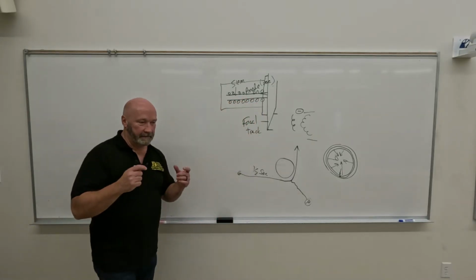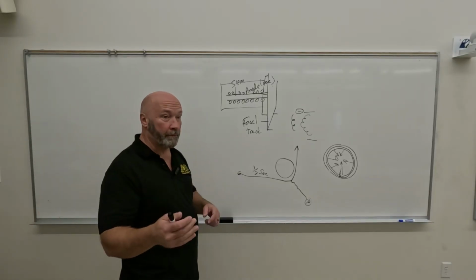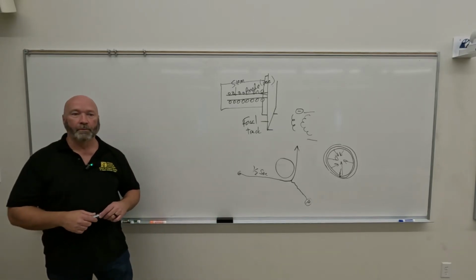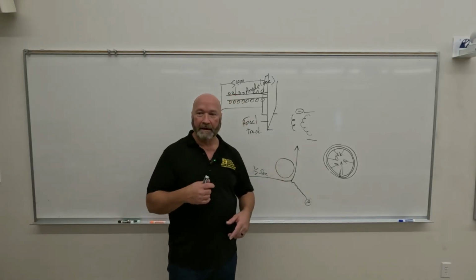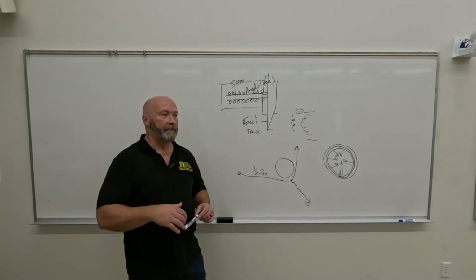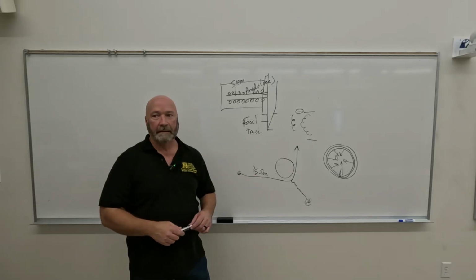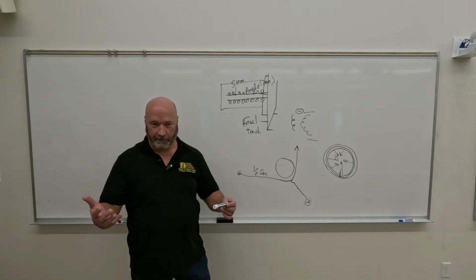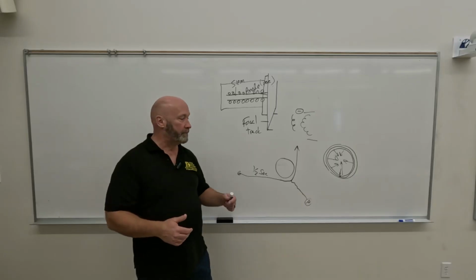All right, so we talked about the focal spot size of mammo tubes, what we refer to as microfocus tubes. Also in mammo, what the disc itself will be made out of, because it's lighter, easier to turn, the entire disc may be made of molybdenum. Molybdenum has a much lower atomic number than tungsten. Okay, so this is your critical thinking question of the day: why might we use molybdenum in mammo tubes instead of tungsten?